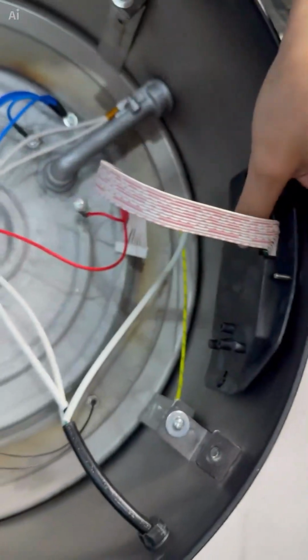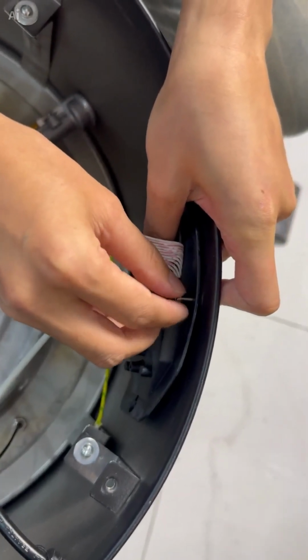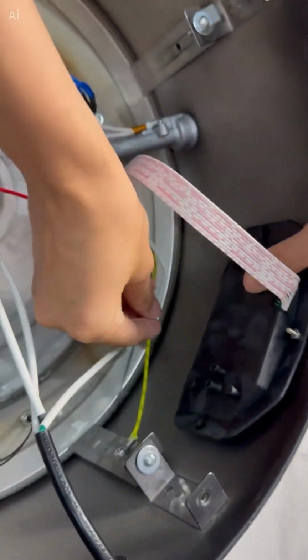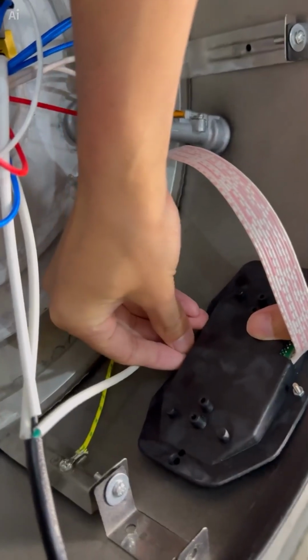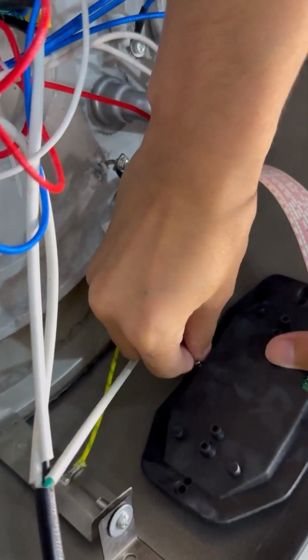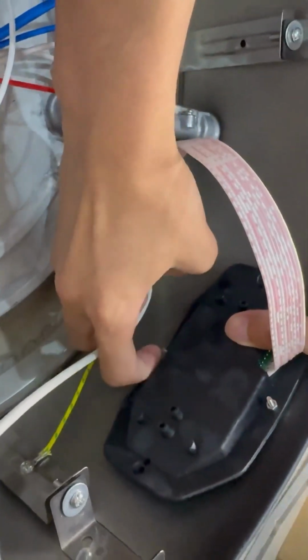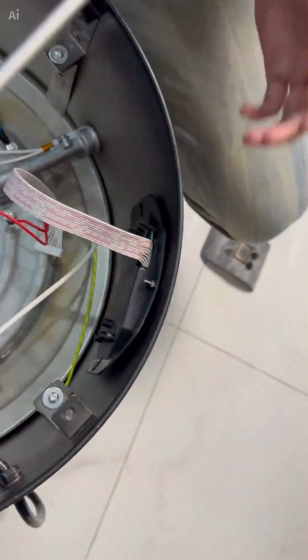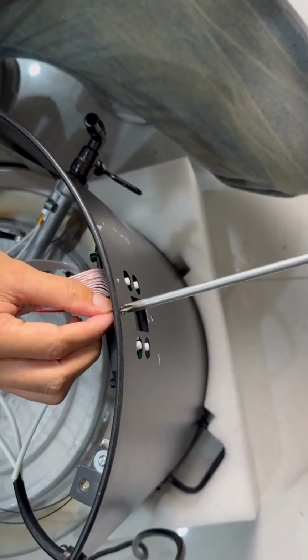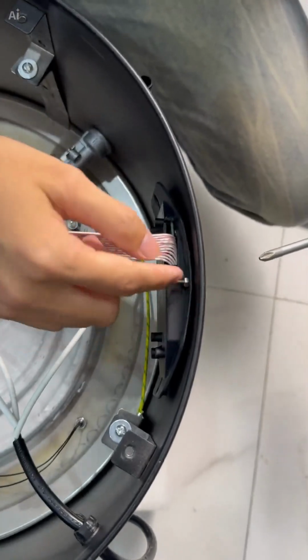Alright, now hold the plastic shell with one hand and slowly screw in the nut with the other hand. Additionally, do the same with the other one, then screw in the nut. Finally, we use this Phillips screwdriver to reattach it. Be sure to hold this nut with your hand to tighten it, and tighten this screw.